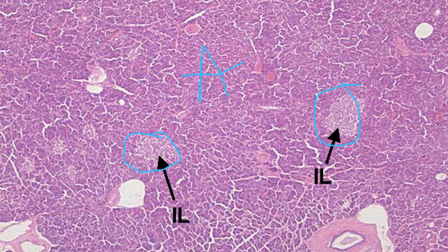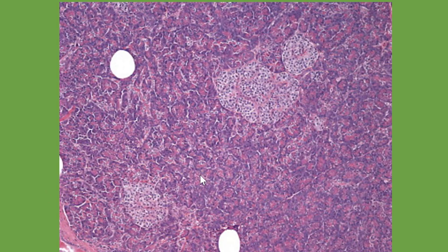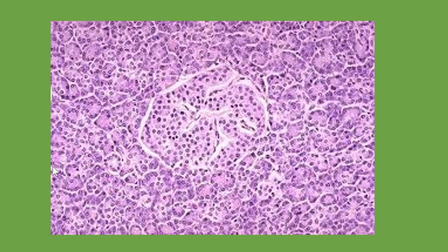Okay, we're going to look at just a couple more pictures of the pancreas. Here we go. So right off, we can see those isles, right? Here's an isle, here's an isle. And when you're seeing this, it's usually an artery or a vein or some kind of blood flow into the artery. So don't worry about those. And here's all our acini, the vast sea. Okay, and one more picture. This one's a little hard to see, but here's our isle here, and this is all acini.